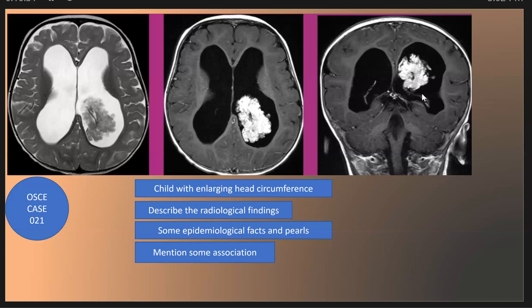And we see here the signal void is still seen, along with the lobulated appearance of the mass. The mass is associated with ventricular enlargement — moderate to marked ventricular enlargement.